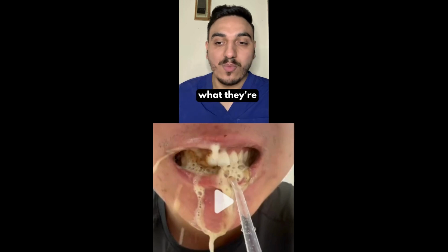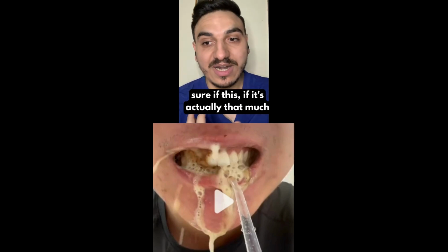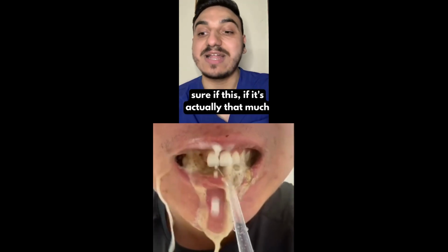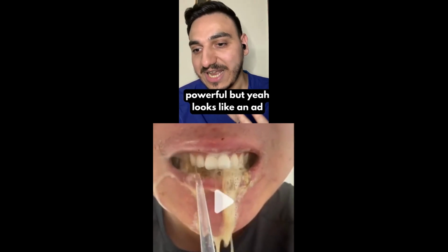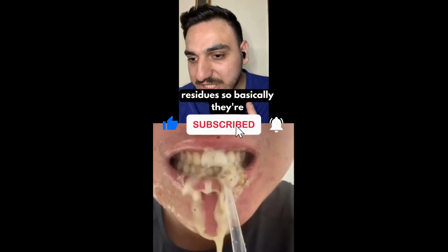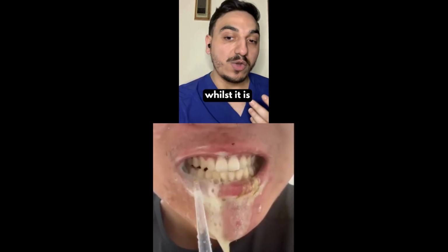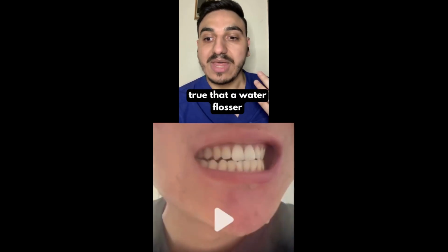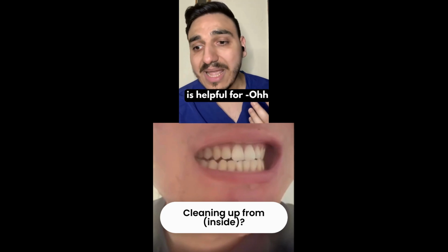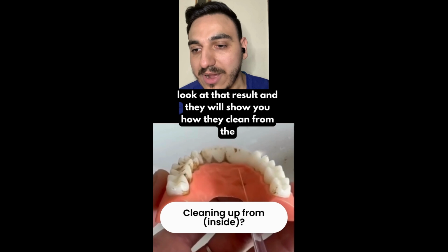I'll tell you what they're actually using, and it's a very useful device. I'm not too sure if it's actually that much powerful, but yeah, it looks like an ad. Effectively clean up food residues. So basically, they're using a water flosser, and while it is true that a water flosser is helpful for all, look at that result, and they will show you how they clean from the inside.